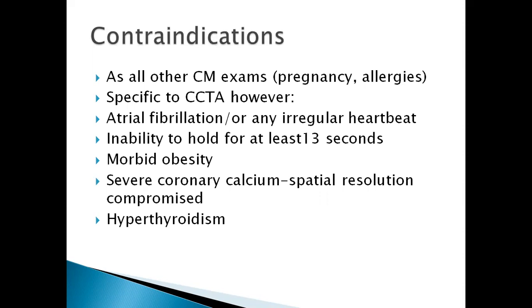So as we know, for all contrast media examinations, there are contraindications that exist. So just like the other exams, for a pregnant person, you normally would not want to go ahead and subject a patient to a CT, a cardiac CT angiography, unless otherwise.